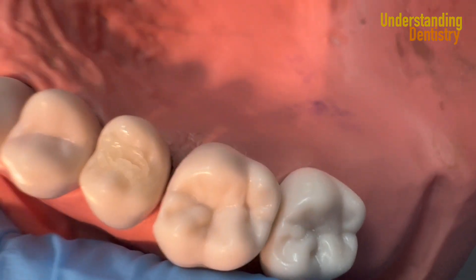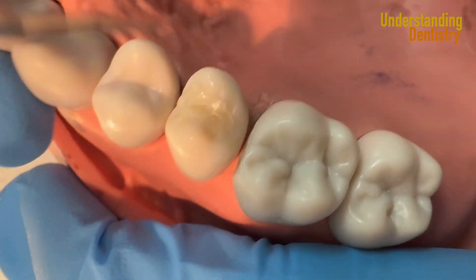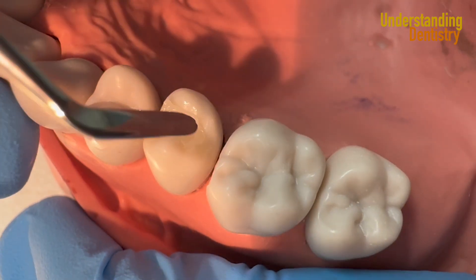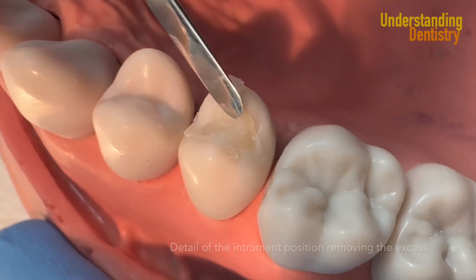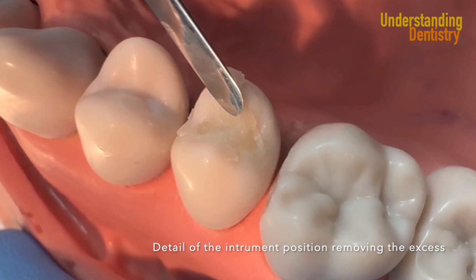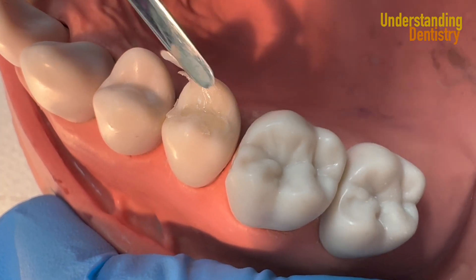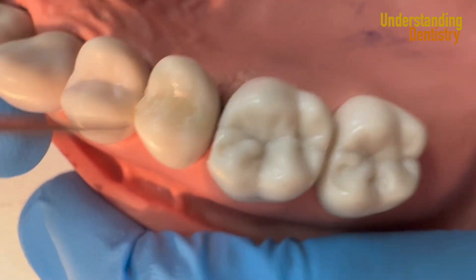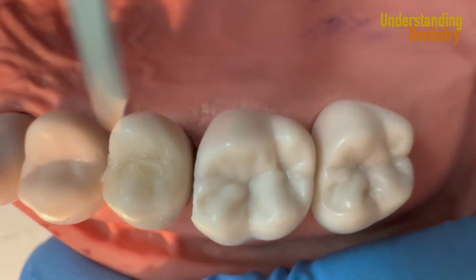This is a resin that you can condense, so it's a very stable resin, which is very nice. If it gets a little bit dry because you take too long, you would just polish your restoration later. Keep your instrument parallel to the surface of the tooth, removing the excess.